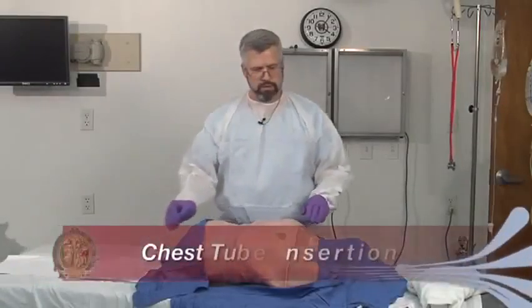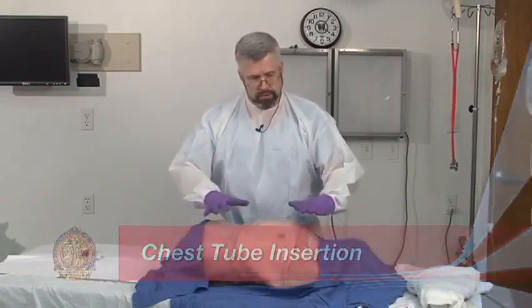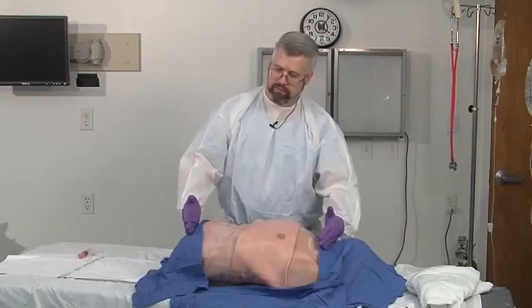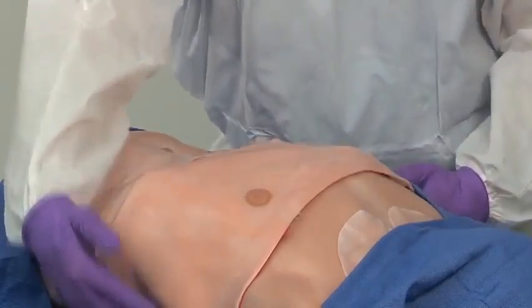The next procedure we're going to talk about is the chest tube. It's a given that when you do these procedures on the chest, we're going to prep widely. We're going to prep from the base of the neck all the way down to the pubic bone, and then from side to side on the chest.